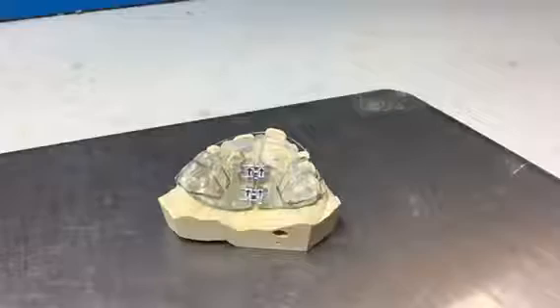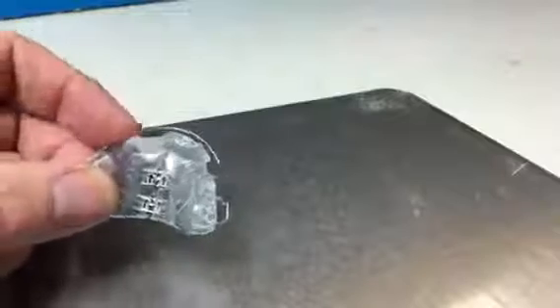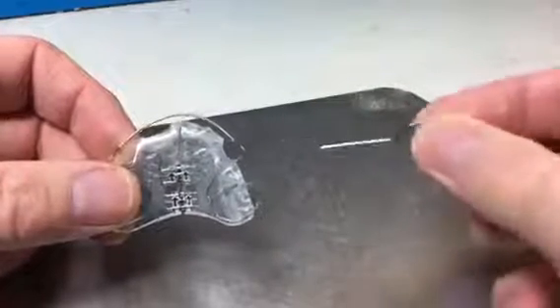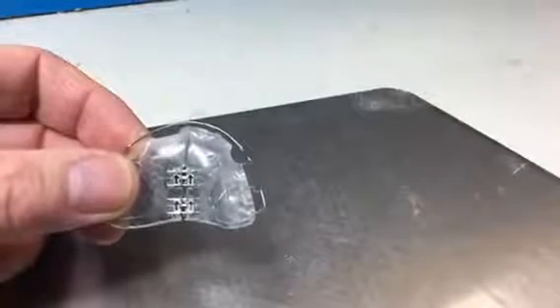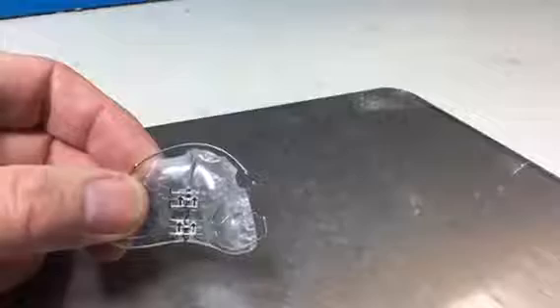Here we have an upper Schwartz appliance. This one has two screws in the center of it. We'll just remove it from the model. All appliances that have expansion screws come with this little adjustment key. You can see the arrows on the screws and they are to be turned in the direction of the arrow.